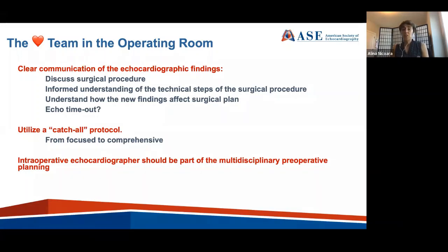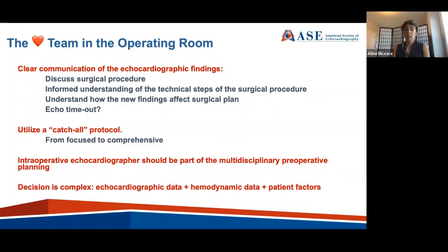The intraoperative echocardiographer should be part of the preoperative planning, and there are multidisciplinary conferences in all the institutions that discuss patients who come for cardiac surgery. So one more thing to keep in mind.